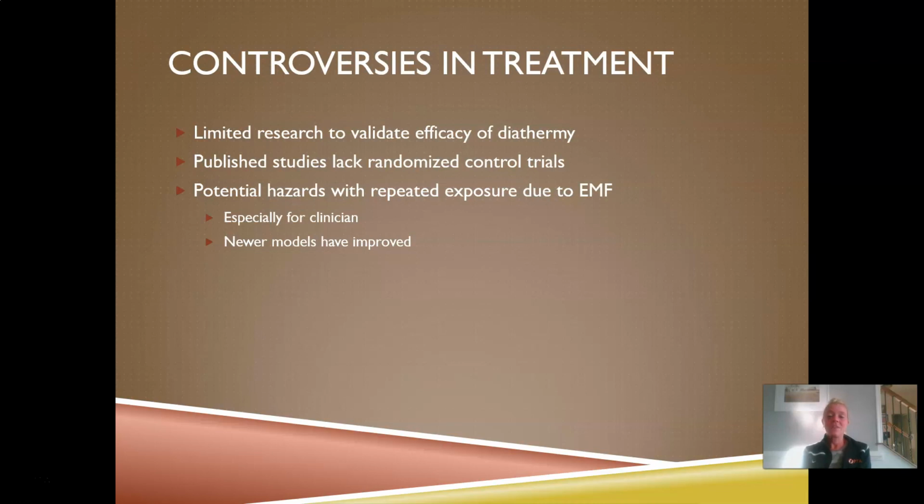Controversies in treatment. There's really not a lot of research out there about diathermy. Diathermy was starting to go away before there was this big push on research. Now that it is starting to come back a little bit, you will probably see a little bit more research out there. Some of the published studies don't have randomized control trials, and there's other flaws with the studies as well.